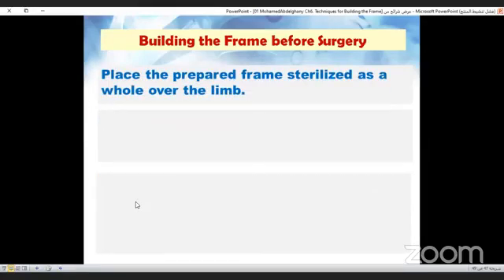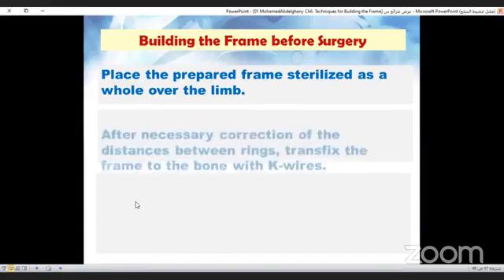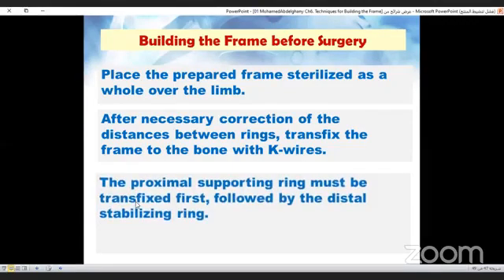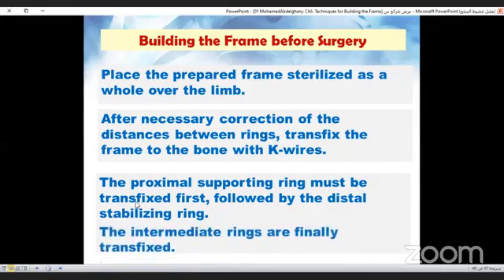And the sterilized prepared frame is placed as a whole over the limb. The frame is transfixed to the bone after necessary corrections of the distances between rings. First, you must fix the proximal supporting ring, then the distal stabilizing ring, and the intermediate rings are finally transfixed.